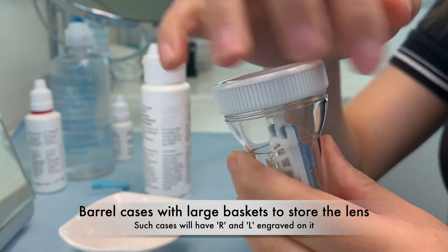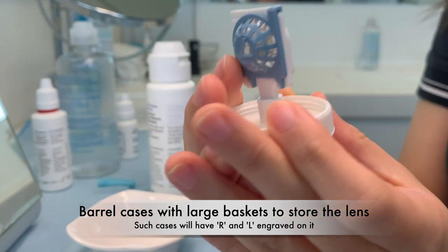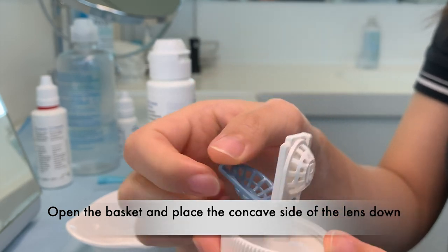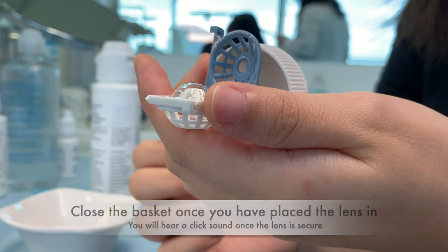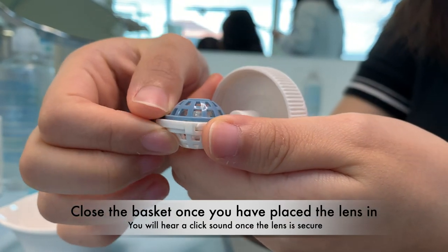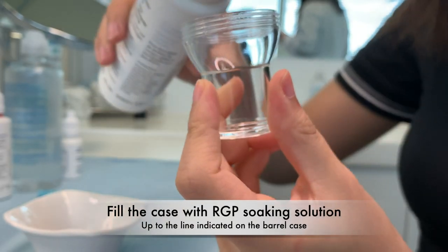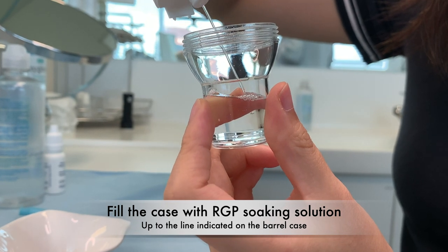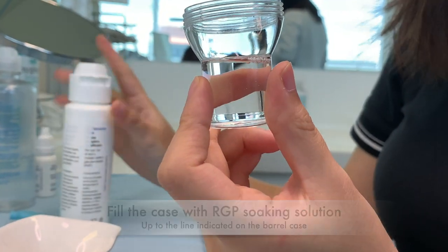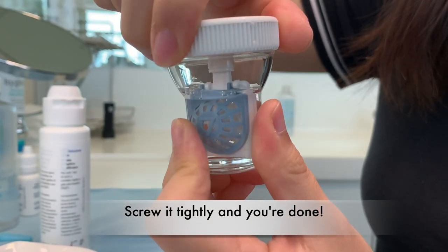Use cases with large baskets to store the lens — such cases will have R and L engraved on them. Open the basket and place the concave side of the lens facing down. Close the basket once you have placed the lens in, and then fill the case with RGP soaking solution to the line indicated on the case. Remember to close the case tightly.